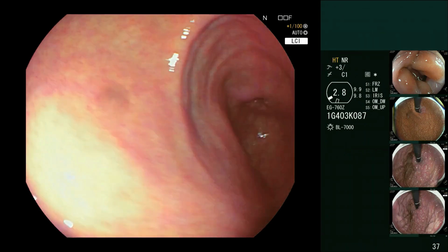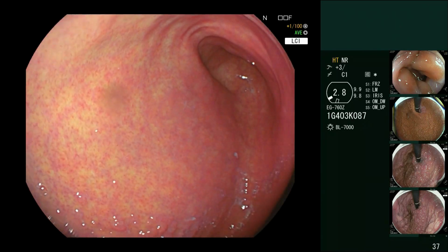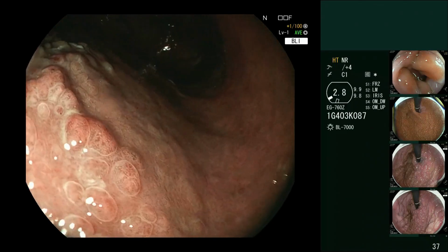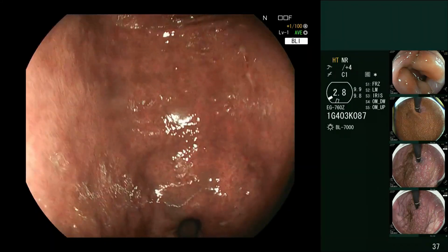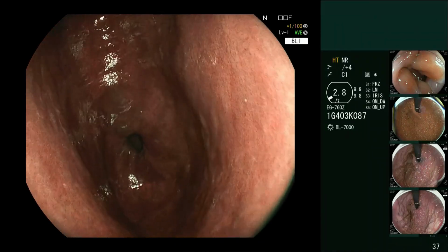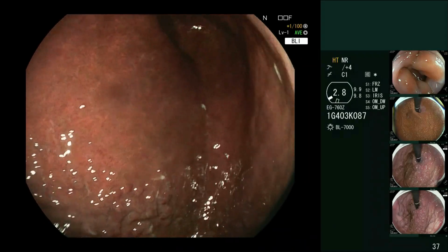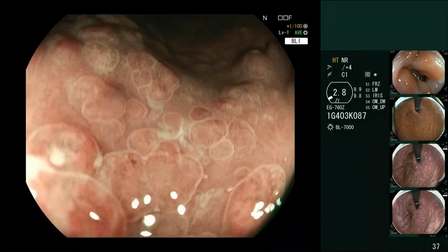The other mode that you should be interested in is a characterization mode. If you see something, this is useful. This is also useful when you get experience at looking for things, but it's not as useful, I would say, as white light or LCI, because these are detection modes. So you have to separate the detection modes of white light and LCI from the characterization mode of BLI. What is characterization?